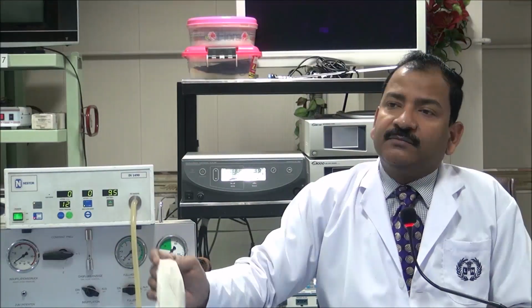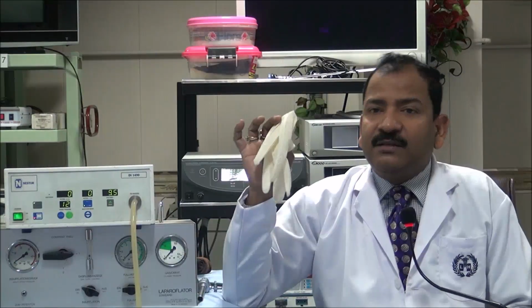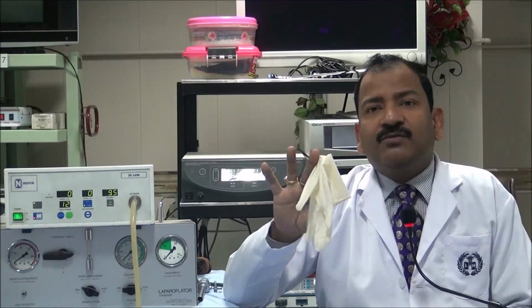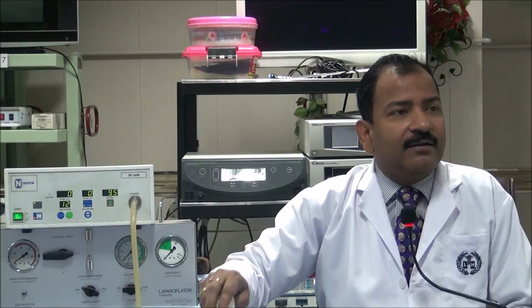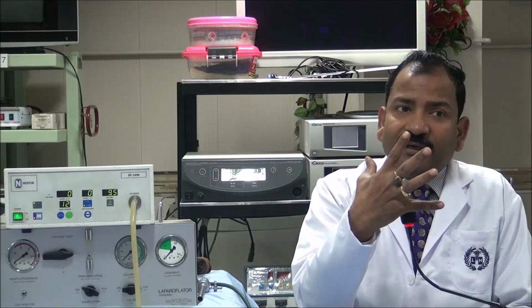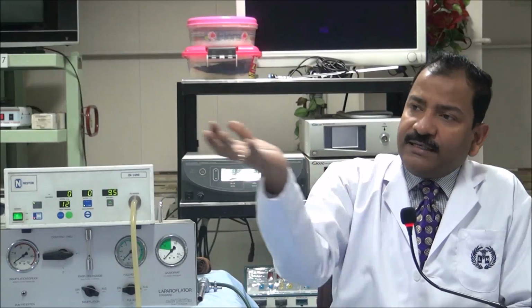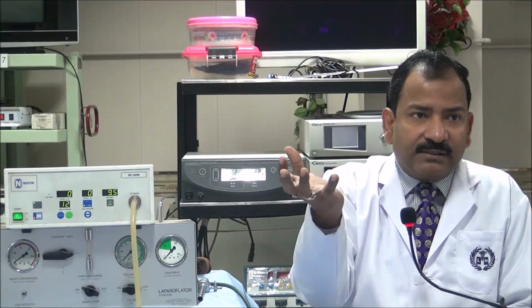Yes. Now it is pre-peritoneum. Just like these gloves, within 200 to 300 ml the pre-peritoneal membrane stretches out, because it is attached with the abdominal muscles and the posterior rectus with fibrous trabeculae.